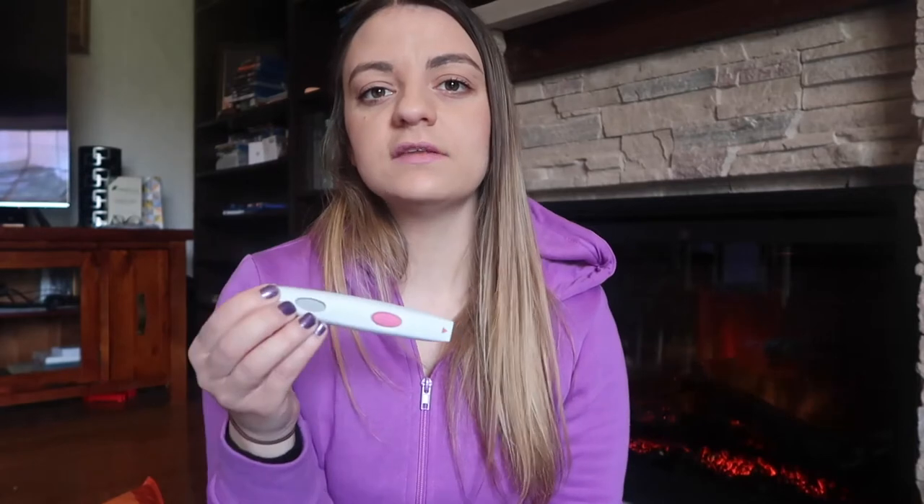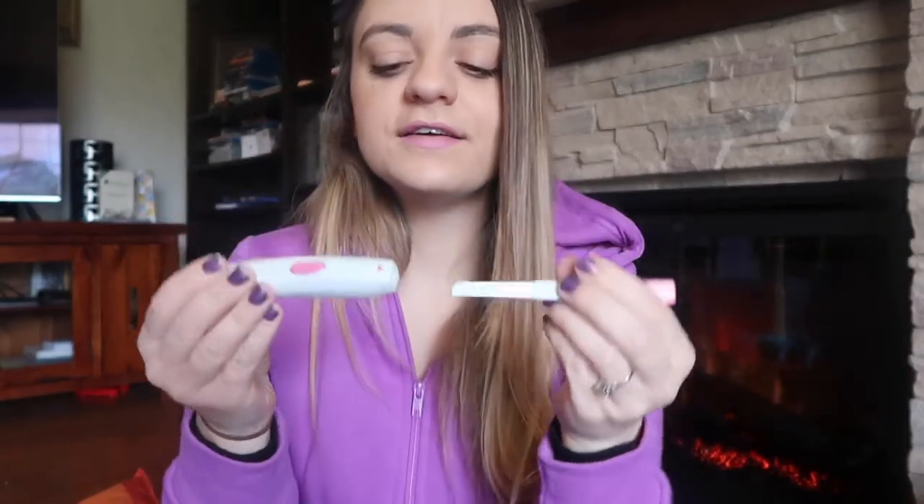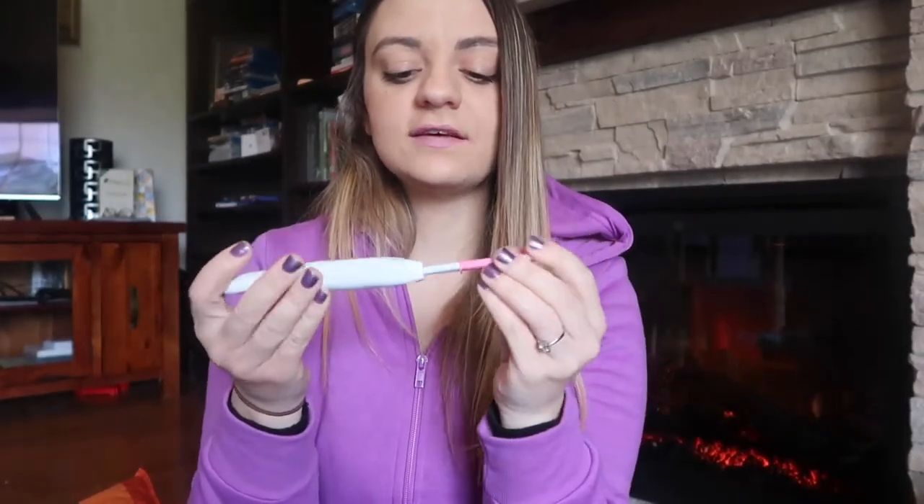It's really important to keep the holder from the previous pack because it gets to know your hormone levels. The first test you insert into a new holder will always have a negative result because it's just picking up and getting to know your hormones. Just look at the little arrows and make sure you insert it correctly until you hear a little click.